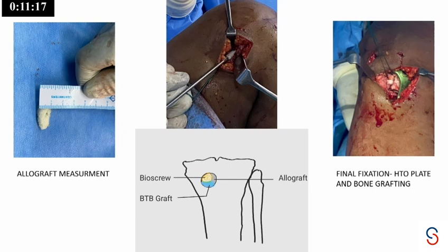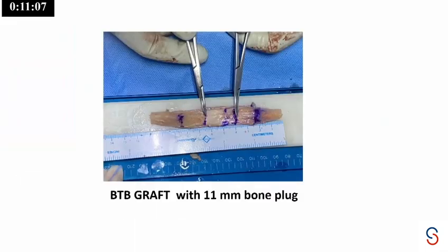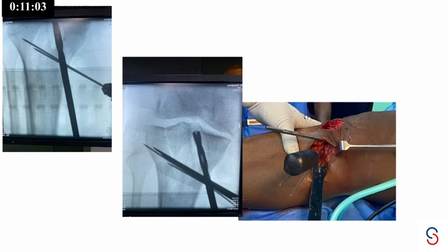So what was the correction amount in this case? 8 mm. 8 mm correction. Yeah. His MPTA was 86, if I'm not wrong. What I'm trying to come to is there is some amount of intra-articular wear also. Yeah, there is. So with respect to the correction also, if you are planning a bigger correction, my question is, when we are using the nuclip type of plate, we do not have the option of compressing the hinge as much unless you use a hinge screw.